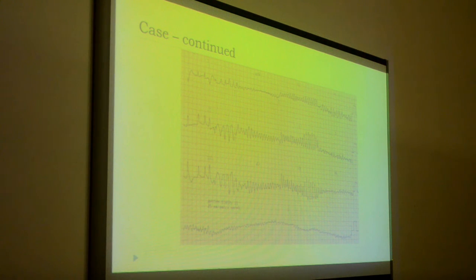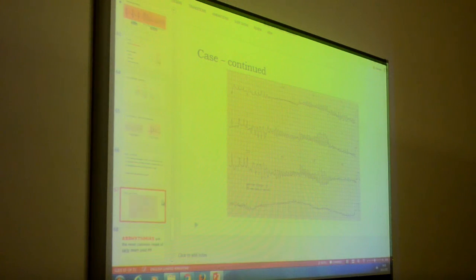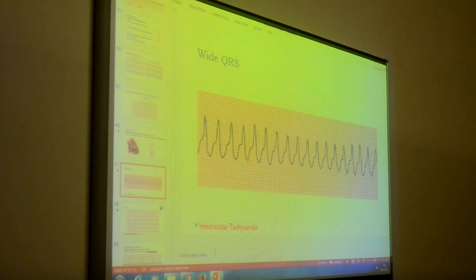Ventricular fibrillation. What do you do? Why is that not ventricular tachycardia? Okay, let's go back to ventricular tachycardia. I'll show you ventricular tachycardia. Look at the difference between this and this. This is regular. This is a clear, obvious pattern.